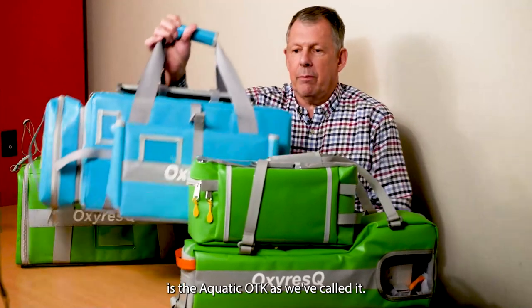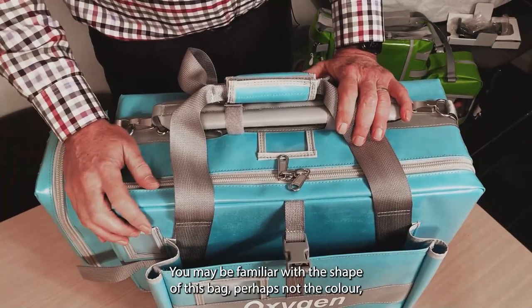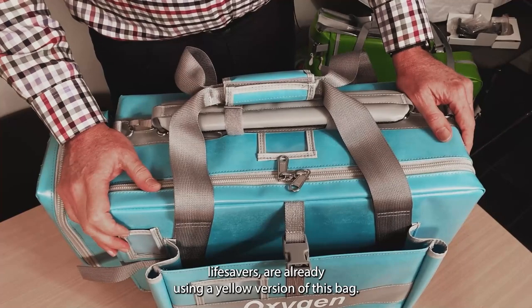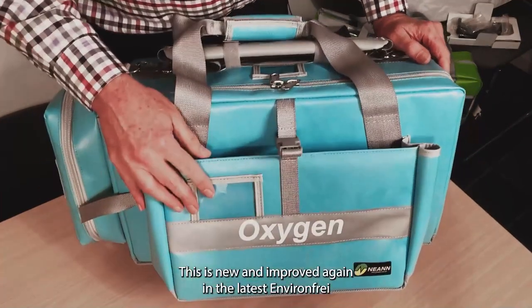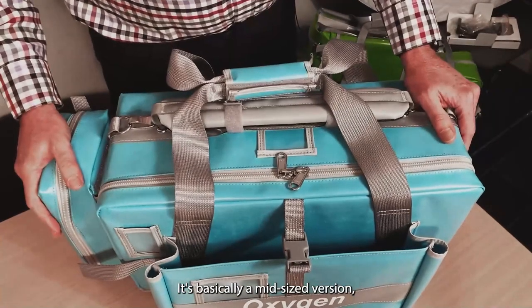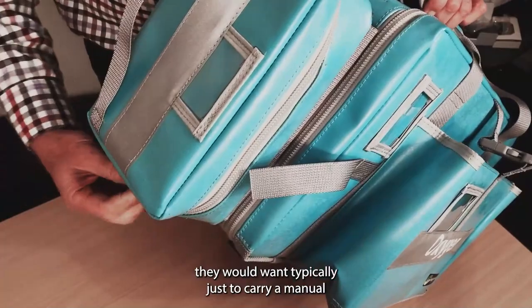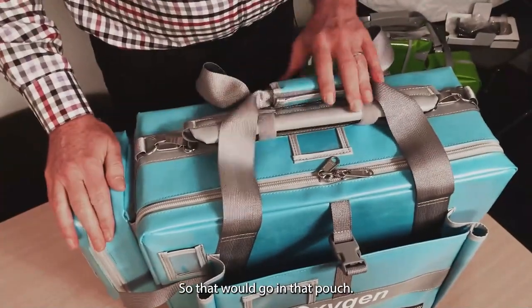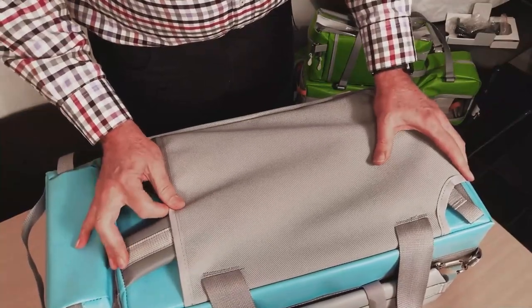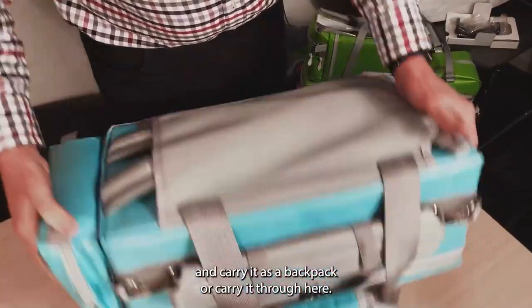The second one is the Aquatic OTK. It has waterproof zips and all that sort of stuff. You may be familiar with the shape of this bag — if you look around the beaches, most surf lifesavers are using a yellow version of essentially this bag. This is new and improved, in the latest Environfrei antimicrobial fabric. It's a mid-size version, and typically based on lifesaving experience, they'd want to carry a manual suction pump which goes in that pouch. There's also a backpack option — you can pull out the backpack straps and carry it as a backpack.